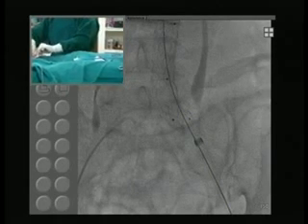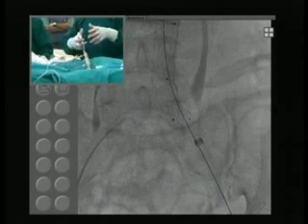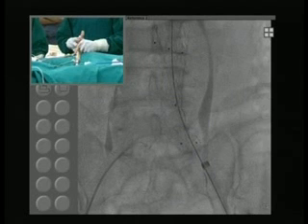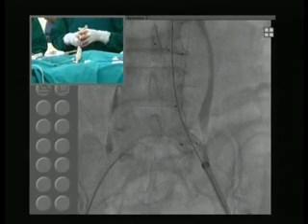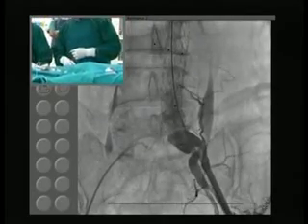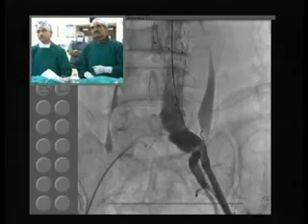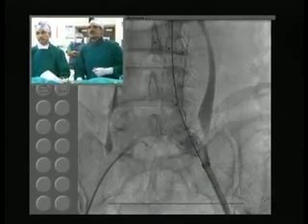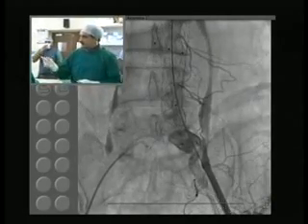Right, so now I'm going to do an angio from below and see what sort of sealing or seating we've got with the device. Yeah, I think it's reasonable. It has come into the common iliac, and it has spared the internal iliac. It's in fact a little off that. So maybe what we need to do is to balloon that so that it smoothens out. Can you get us the Reliant balloon, please?